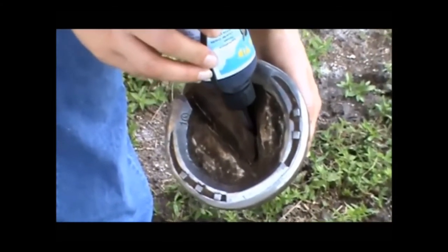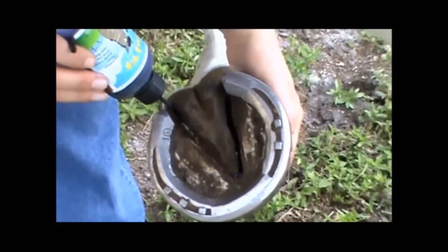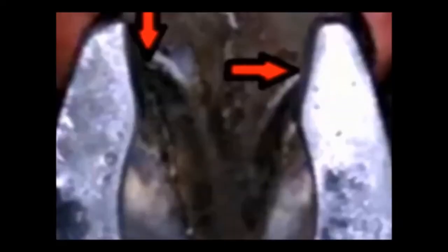Veterinarians and farriers all agree: accurate application is the difference to killing thrush and getting rid of the cracks, making the frog and hoof healthier. The tip easily gets into hidden little places where thrush likes to hide — under shoes — and is perfect for egg bars, slide plates, and pads. The Thrush Tip's construction discourages clogging. It has a valve to control liquid flow and leakage.